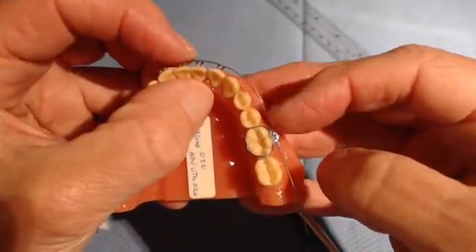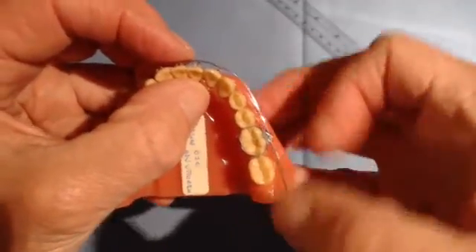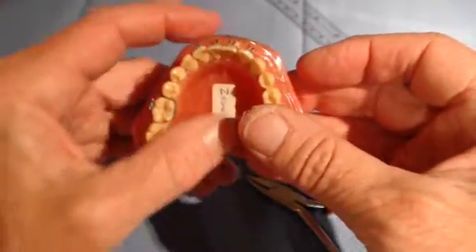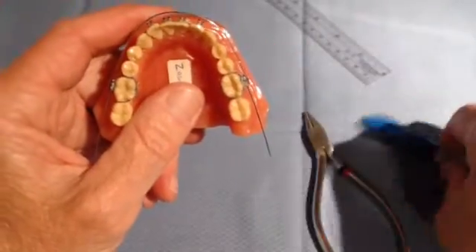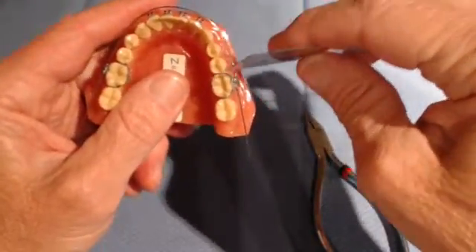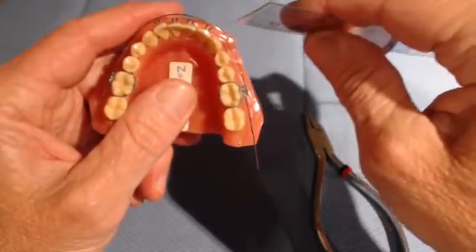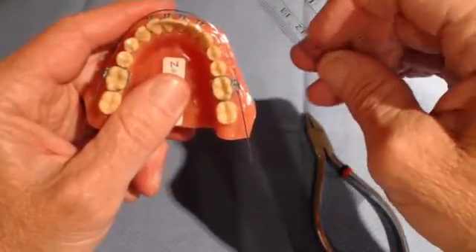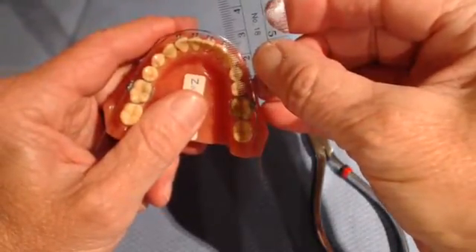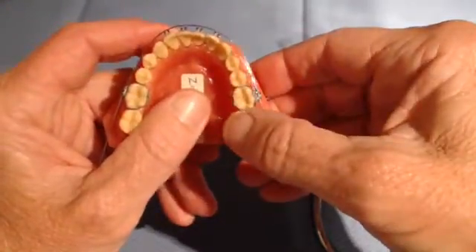Incidentally, the buccinator muscle pushing on this wire will also help advance the incisors, and you will need to determine how much advancement you need. We know from tooth anatomy that the normal tooth mass from the distal of the 2 to the mesial of the 6 is 8 plus 8 plus 7, which is 23 millimeters. So you can take your handy plastic ruler and measure from the mesial of 6 to distal of 2 — if you can get 23 millimeters in there, that is all the space that you need.